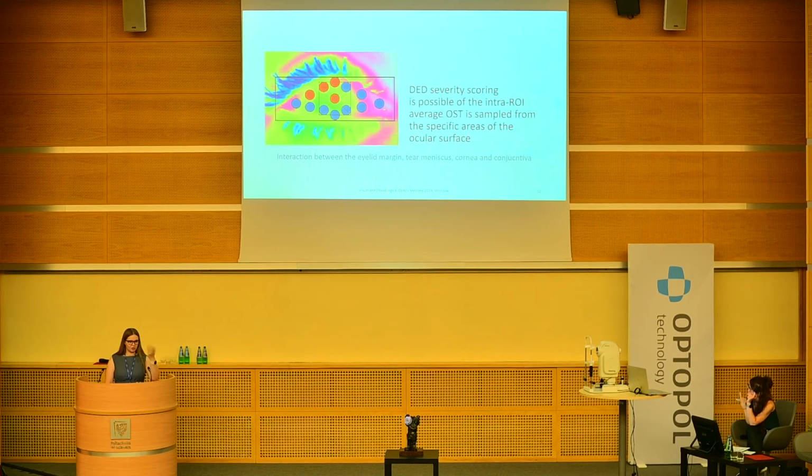So together with the ROTA quiz here and the group of biomedical engineers, we thought, why just those areas? Those areas are specific because they show interactions not only between the eyelid area and tear meniscus, but also limbus and cornea. So they take many factors into account, how the tear breaks, and how the eyelid surface warms up.